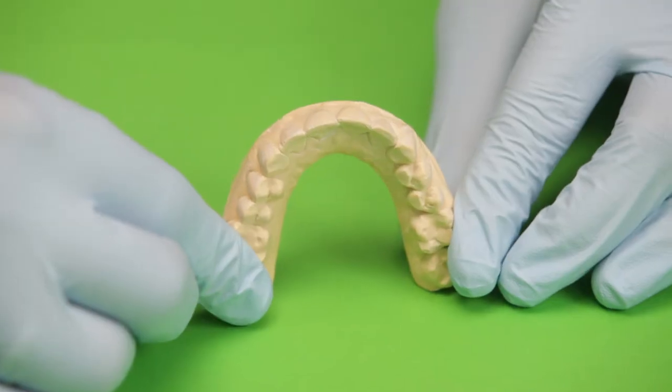Hello everybody, welcome back. I've been getting questions from doctors asking if it's possible to fabricate a bleaching tray chairside and deliver it to the patient at the same appointment. Let's take a look at how a bleaching tray can be fabricated chairside.